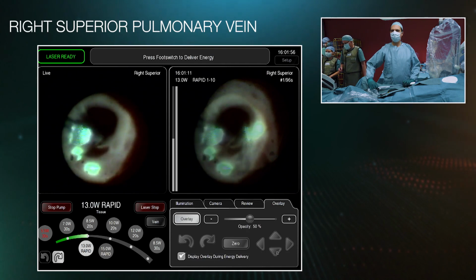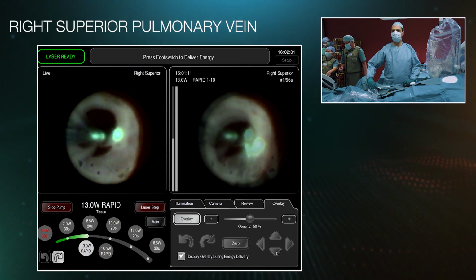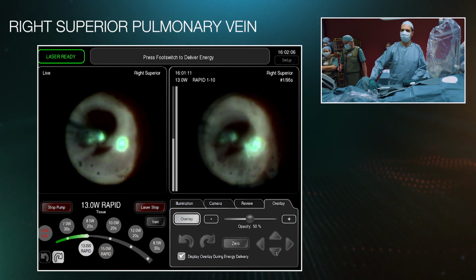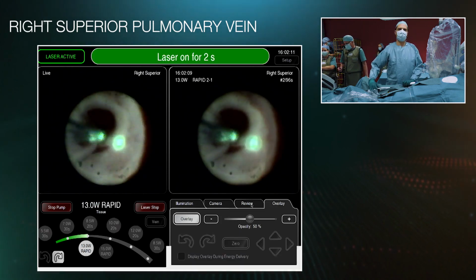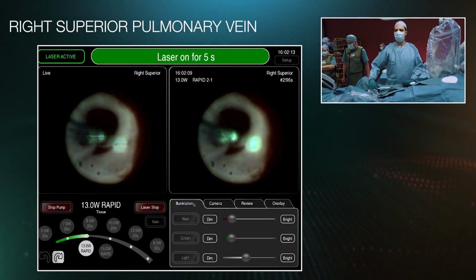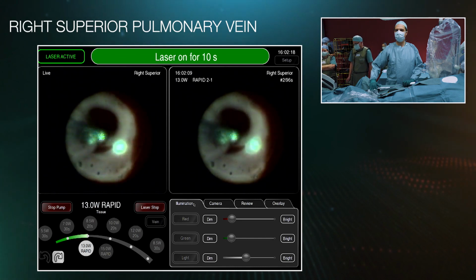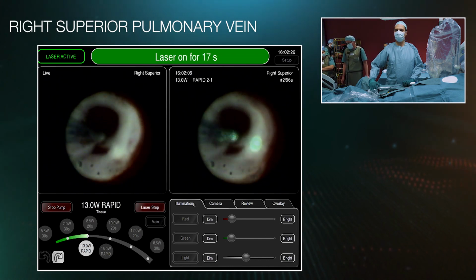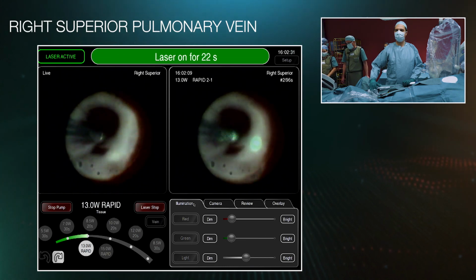So here you can nicely see the lesion. You see this white line, I'll put the pointer on it, here. This is the lesion we've made, and here we need to continue. So here I am going to continue, and we can go under this portion. Very nice. So I'm guaranteed to have overlap here. I can easily visually confirm my previous ablation position. And now, of course, because we've rotated the shaft, the blind spot is no longer in the way, and we can also guarantee that we're doing it safely, not ablating in the blood pool.